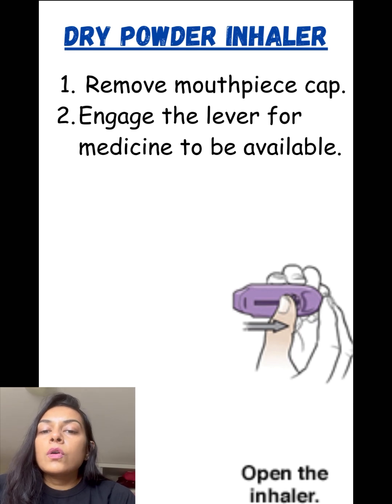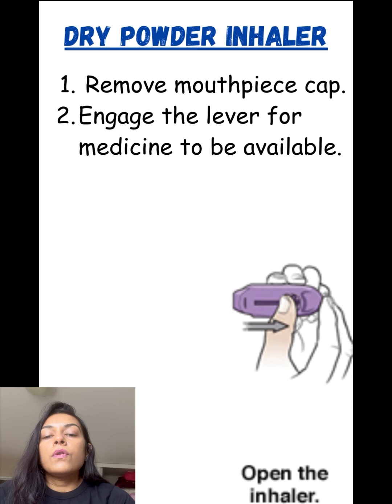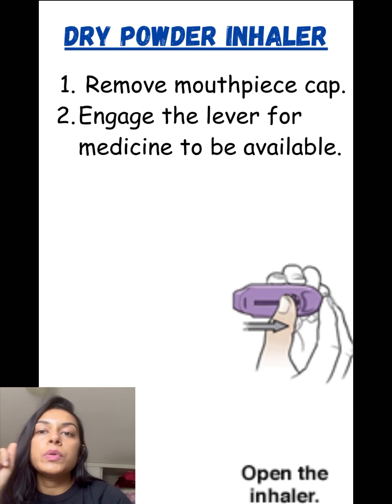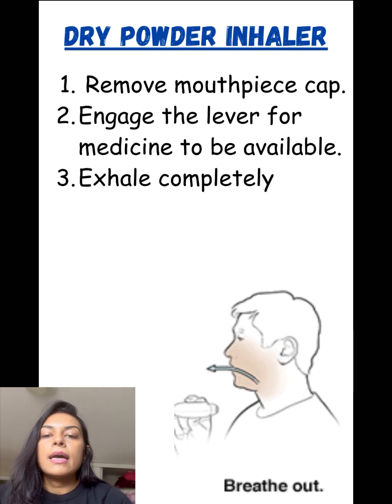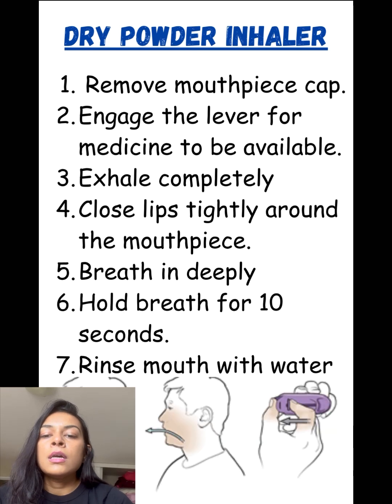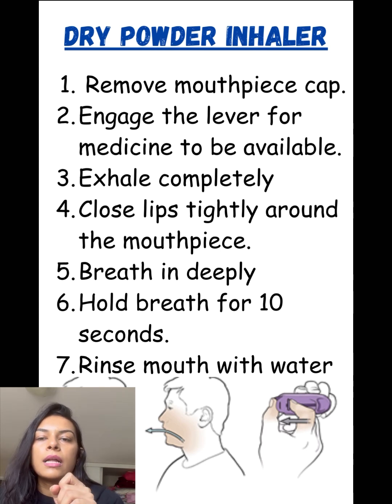For this, also remove the mouthpiece cap and engage the lever for the medicine to be available. There is one lever on the side which we need to engage, and then exhale completely. Close the lips tightly around the mouthpiece, and breathe in deeply and rapidly through the inhaler. Hold the breath for 10 seconds and then rinse the mouth with water. Breathe out slowly, close the inhaler. We need to disengage that lever.